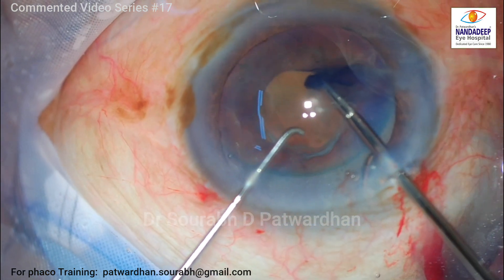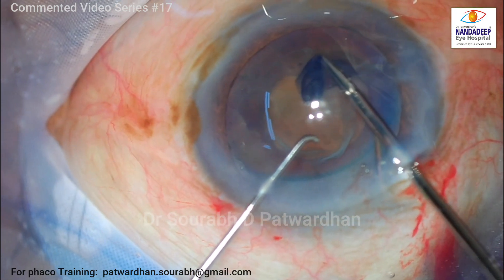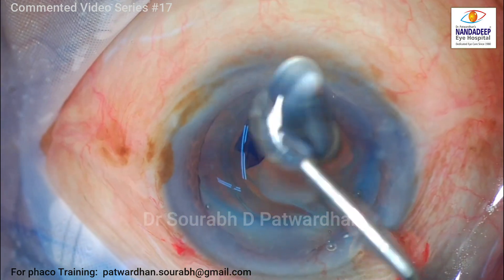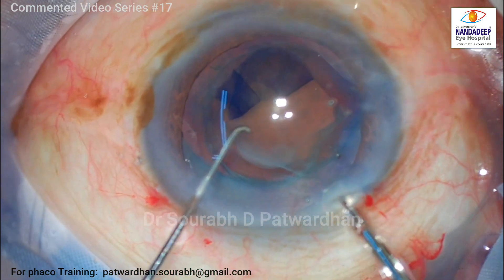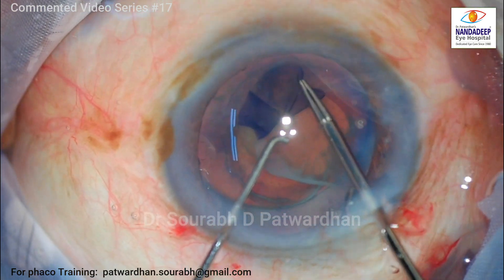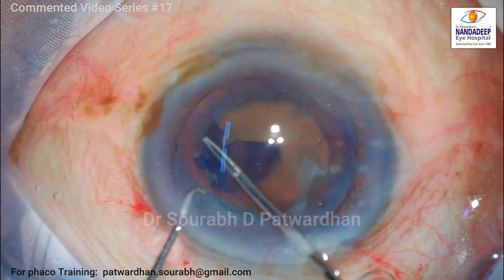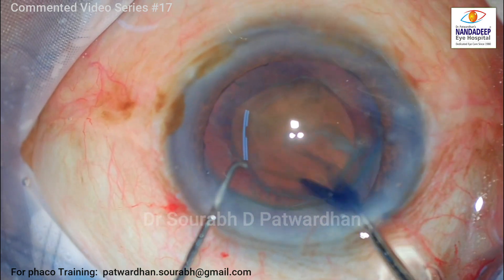I am using Hilu coat, which is similar to Viscoat, for pressing over the anterior capsule. You can see those radial folds in the anterior capsule as I use the cystitome to progress the capsulorhexis tear. It's best to use micro-capsulorhexis concepts here — always remember small steps and always give a tangential pull. Never pull the capsulorhexis tear centripetally, because with weak zonules they will not produce counter-traction and the zonules may start breaking. Never try to pull in one single maneuver as in a normal case; always give small tangential pulls all around.